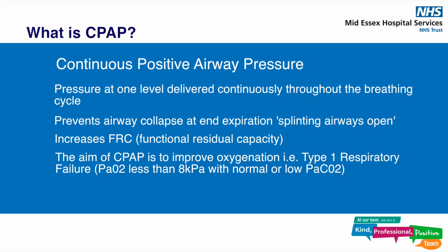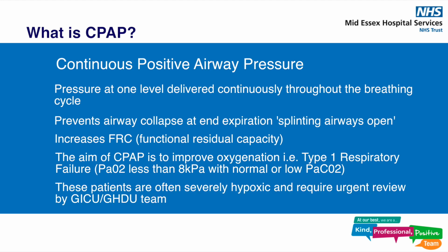The aim of CPAP is to improve oxygenation, i.e., to improve type 1 respiratory failure. These patients are often severely hypoxic and require urgent review by the critical care team. CPAP will not be covered further in this training video.